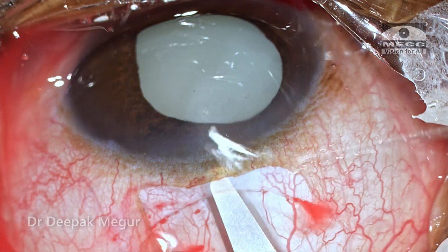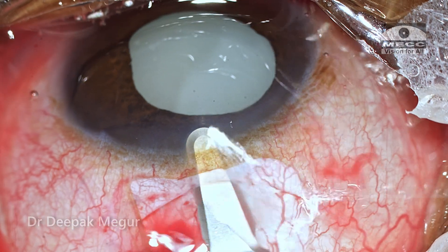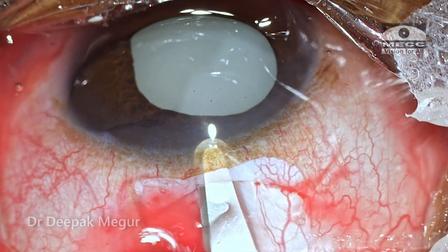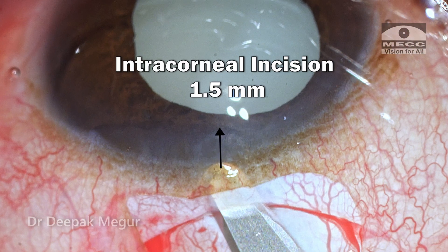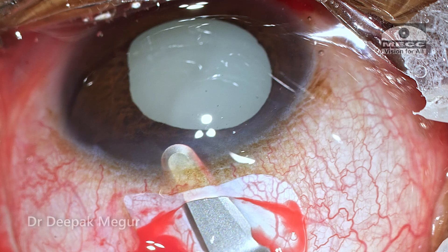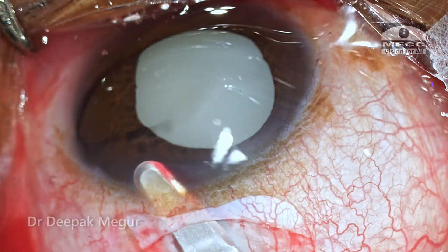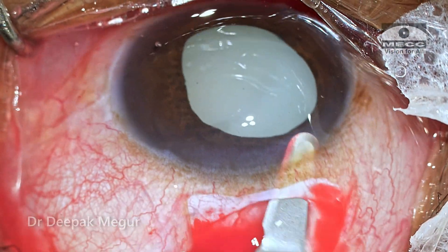The crescent knife is being used to create the sclerocorneal tunnel. At the midpoint, the scleral incision is about 1.5 millimeters posterior to the posterior limbus, and intracorneally it's going to be around 1.5 millimeters anterior to the limbus, where we'll have the internal point of entry. This corneal wall is going to help us create the self-sealing incision.